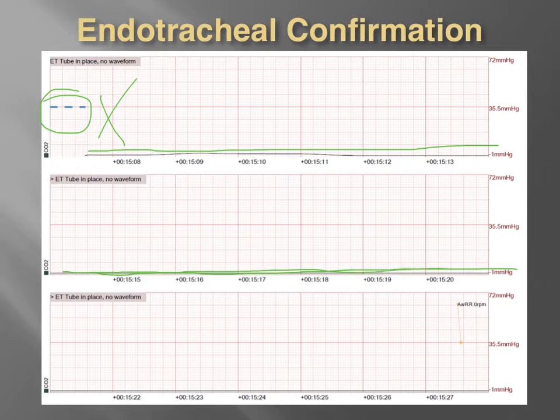Okay, the flat line is showing that this patient's being ventilated, or it shows that the capnography is hooked up. If we just hooked up a capnography device right now, as soon as it's hooked up, the computer senses that there's a pathway down that tube to where it can measure carbon dioxide, but it's not measuring any carbon dioxide. It can't sense anything. So it's going to give a flat line versus a dotted line. Okay, so it's important for us to understand that.